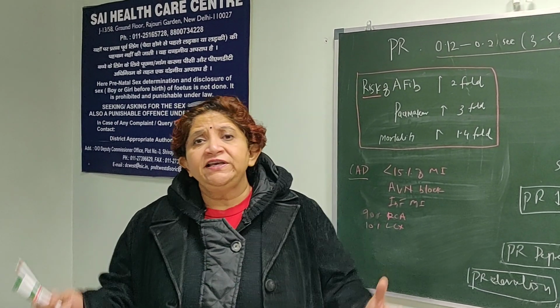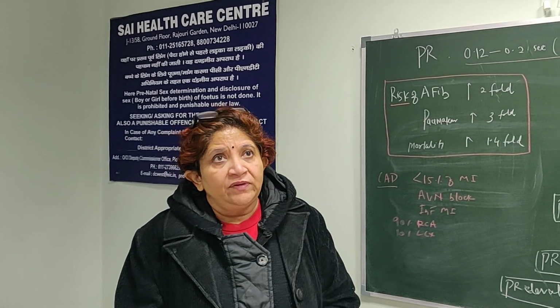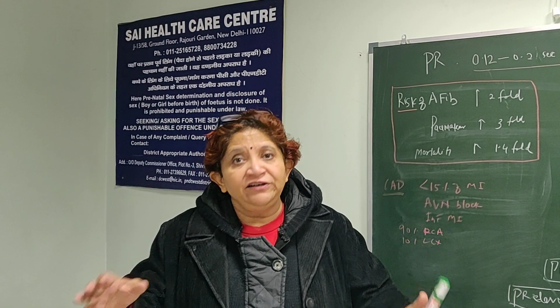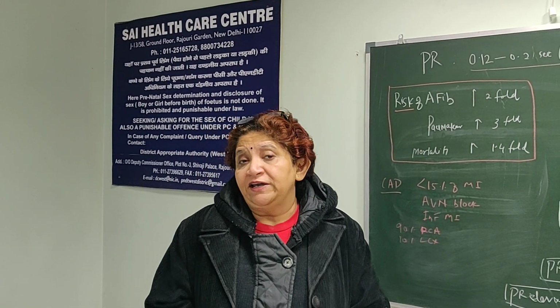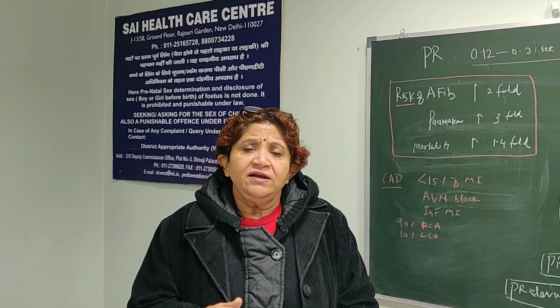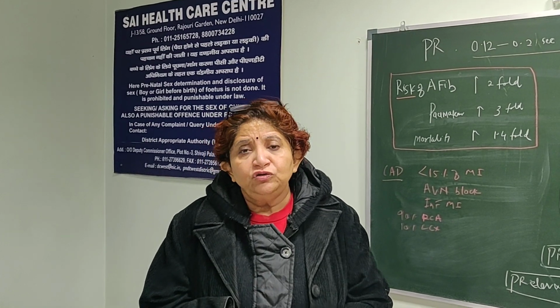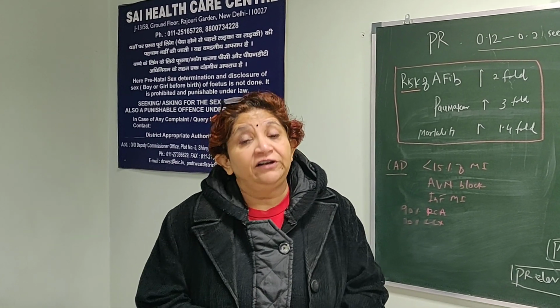All of us have seen ECGs with first degree AV block, and most of us consider it as a very benign condition because most of the time first degree AV block is at the level of AV node and it is mostly asymptomatic and it can be physiological also. So for us it's a benign condition. But is it truly a benign condition?